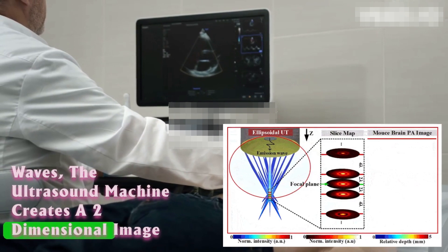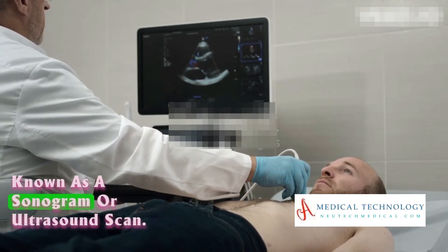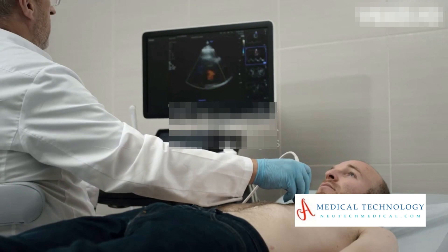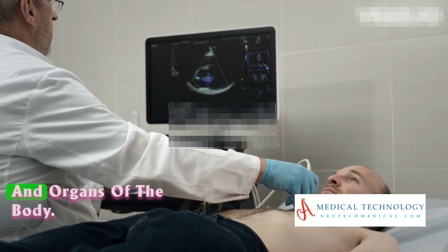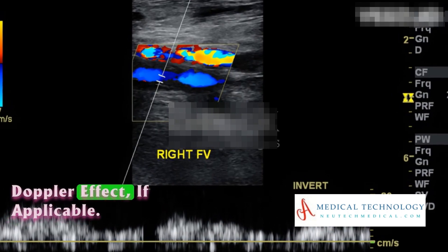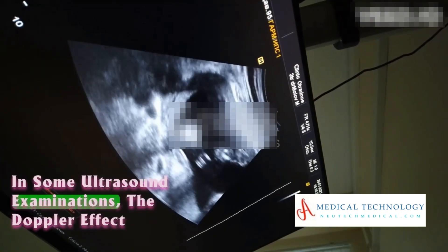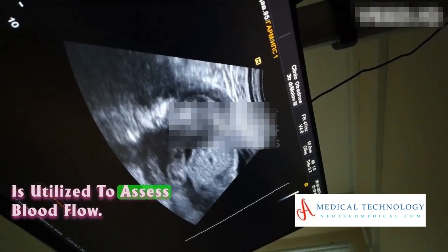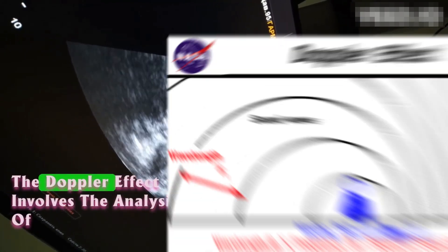Based on the information gathered from the reflected sound waves, the ultrasound machine creates a two-dimensional image known as a sonogram or ultrasound scan, representing the internal structures and organs of the body. In some ultrasound examinations, the Doppler effect is utilized to assess blood flow by analyzing changes in frequency of the reflected sound waves due to moving blood cells.